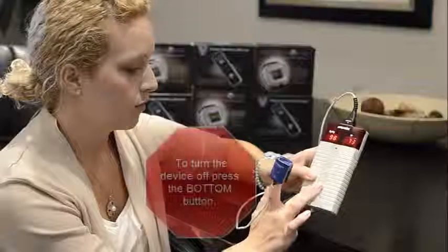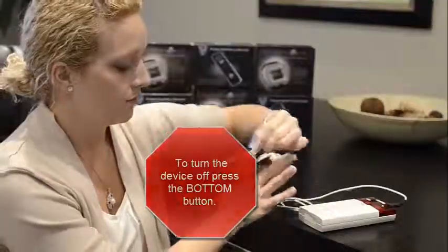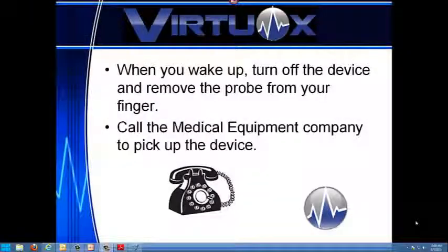Step 6: when you wake up, turn off the device and call the DME company to pick it up. Congratulations on successfully taking your overnight oximetry test.